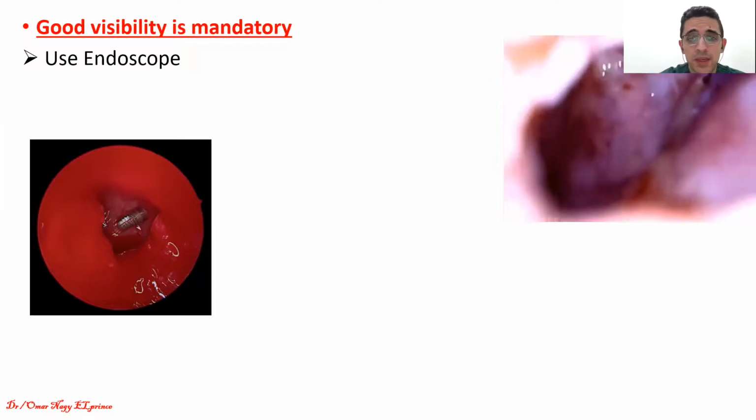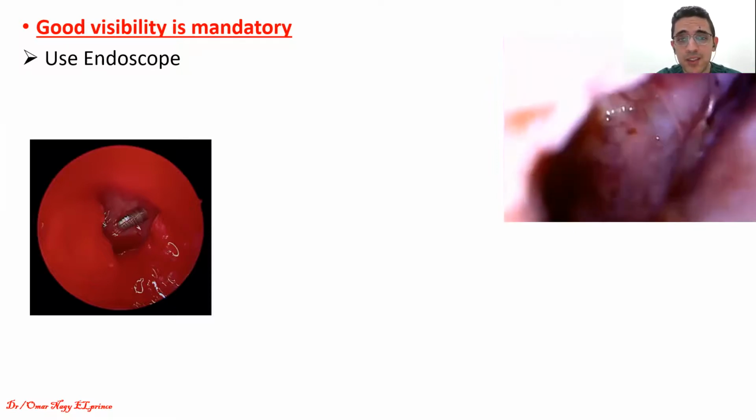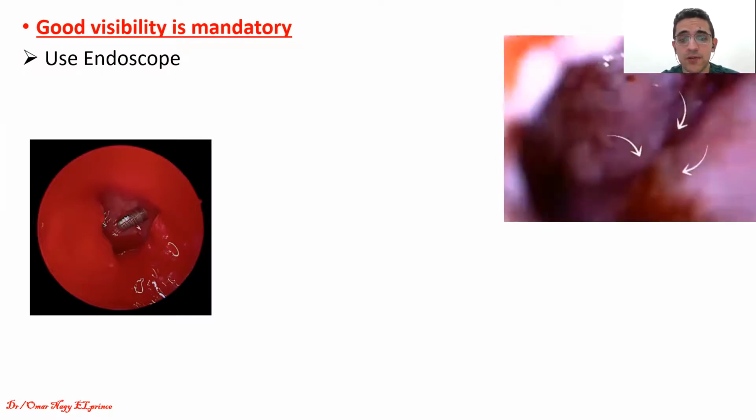So our first tip: make an immediate pre-operative radiograph. Second tip: try to choose the scope for good visibility.